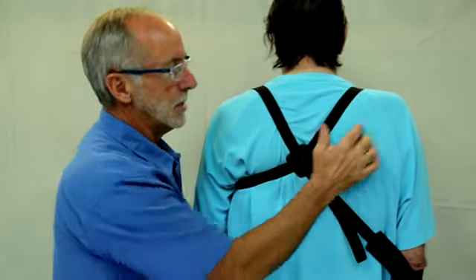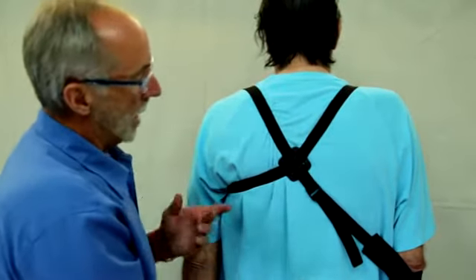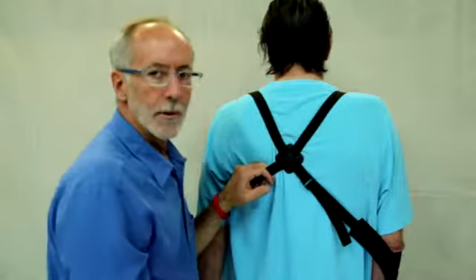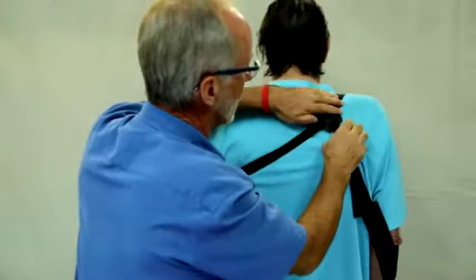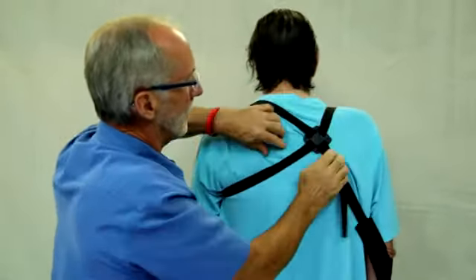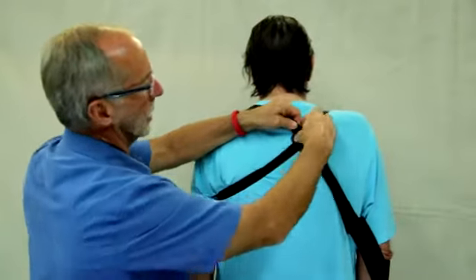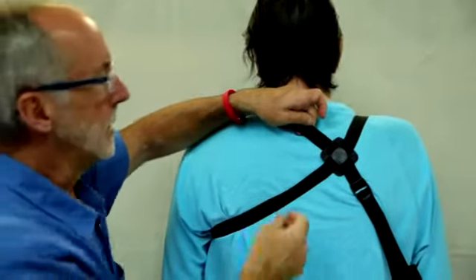I like to set the foretap position based on how well it's reducing the subluxation and comfort. As an example, maybe a guy who has got a really big heavy arm and this position isn't doing a great job of reducing the subluxation — we can take this foretap and run it way up over here. Be careful to keep it off the spine of the scapula, put it over the belly of the infraspinatus, and that might do a better job of reducing the subluxation. You can lock it in place once you get it there — you can lock it in any of these positions.